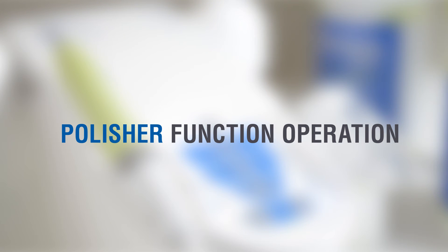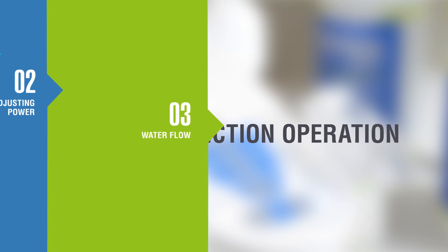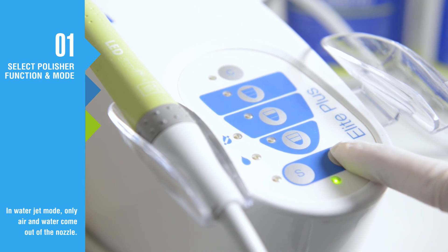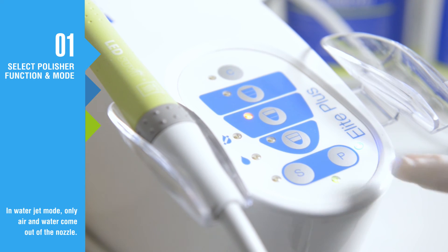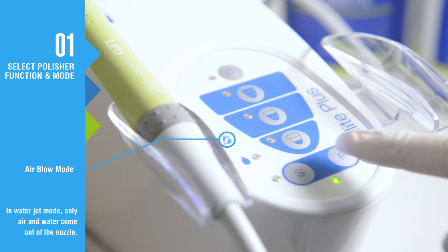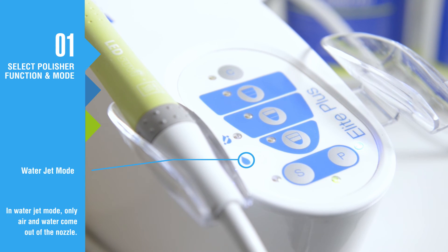Press the P button to activate the polisher mode. A second press of this button activates the air blow mode and a third activates the water jet mode. When using the polisher, only work modes two and three will be activated.